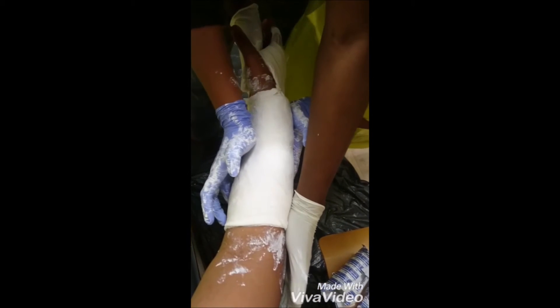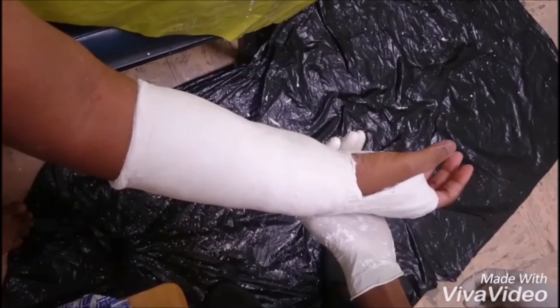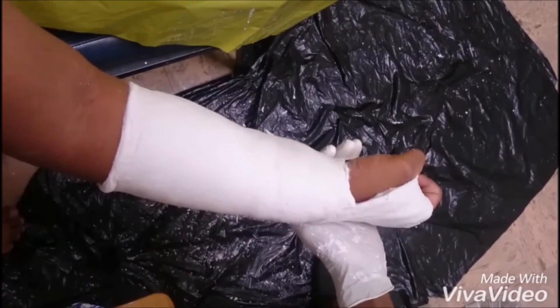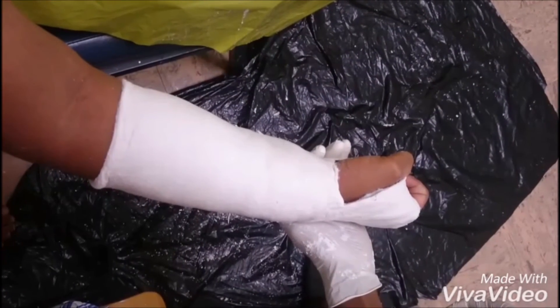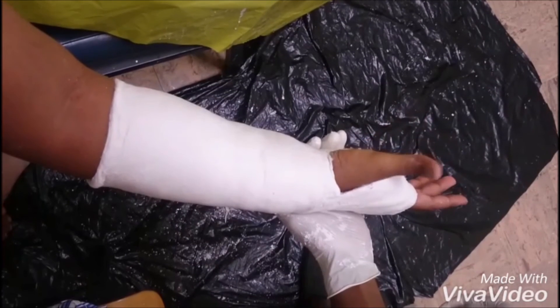To stabilize the reduction, 3-point pressure is applied as shown in the video. One hand is placed on the radial styloid, the other in the middle of the arm, and the other at the elbow. After finishing the molding, ensure that you clean the patient adequately and ask the patient to flex their fingers and thumb to ensure adequate movement of the joints.